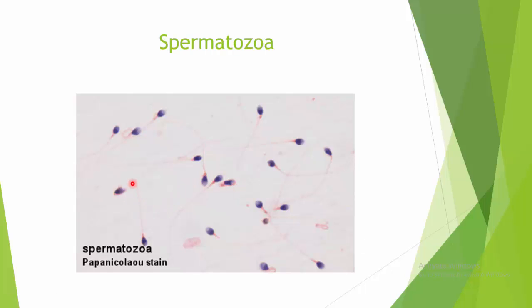Here are some spermatozoa. That's just a fancy name for sperm. There's a head, a midpiece, and then a tail. The head has the penetration ability. The acrosome penetrates the egg, and the midpiece supplies the energy, and the tail is for the motility. So you had those things in the lessons. Head, midpiece, tail. This is for penetration. This is for energy. This is for motility.